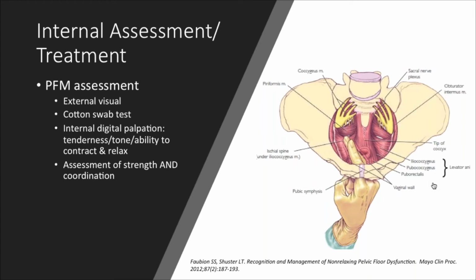The difficulty here is we do have a sense of what the function is and the ability to contract and relax, but we do not have a sense of what the translation of that muscle function is to the bladder. That's where ultrasound can be a really nice, efficient way. You may feel a great contraction manually, but if you take a look at it on ultrasound, your patient with stress incontinence, when they're running, may not have any sort of translation of that pelvic floor muscle contraction to the bladder at all.